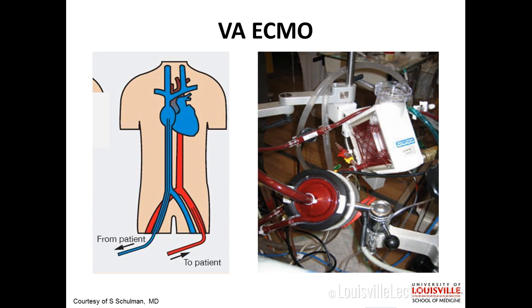Yes, you can use a balloon pump for refractory ventricular tachycardia. There, you're basically trying to decrease afterload and augment cardiac output by any means that you can, but usually that's just going to be a bridge and a very temporary thing while you're trying to get everything else under control.